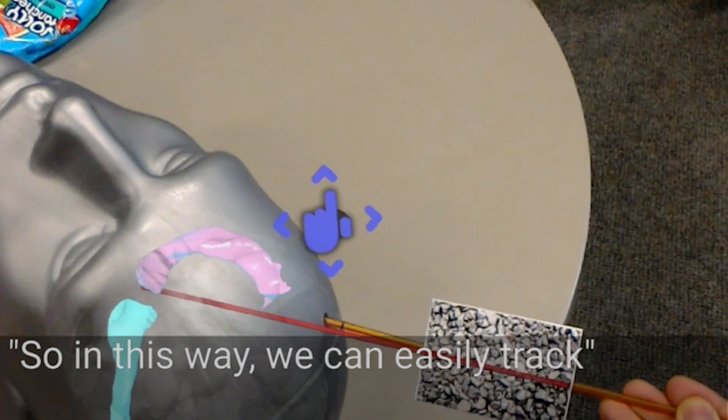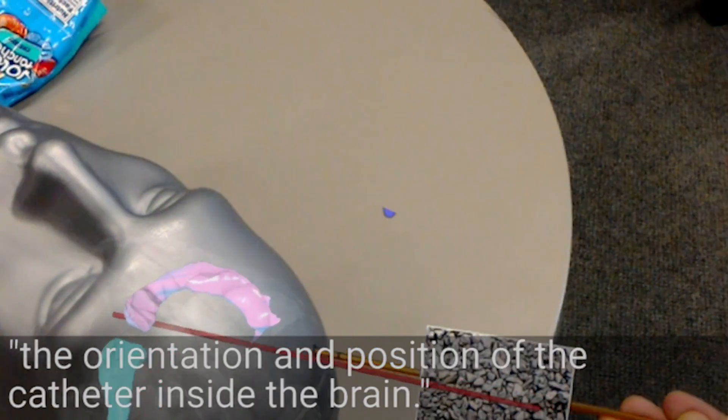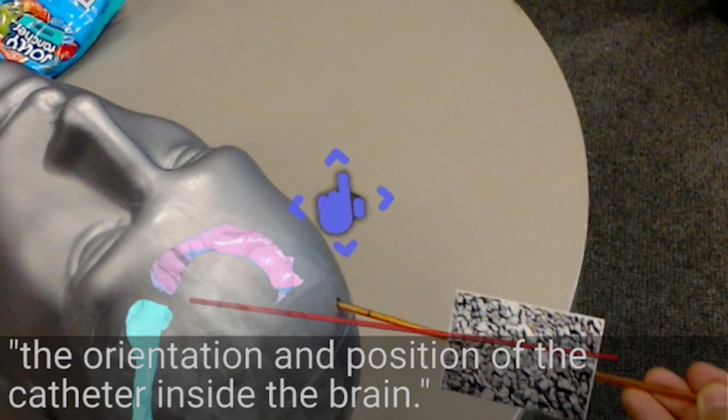So in this way, we can easily check the orientation and position of the catheter inside the brain.